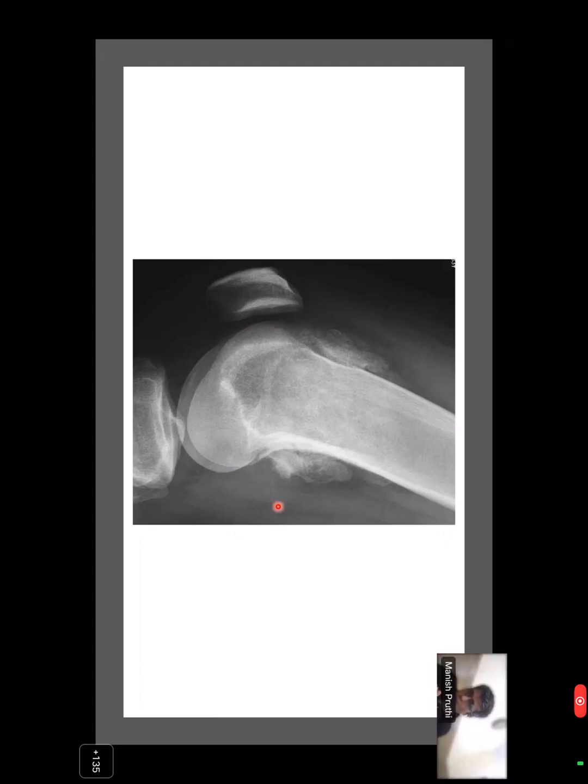And this is not a periosteal reaction, because periosteal reaction is periosteal new bone deposition. This is a dense bone which is surrounding. There is a mineralized mass. Sometimes you see a densely mineralized soft tissue component of a malignant bone tumor. But this looks like the lesion rather than a periosteal reaction, because you can see that the periosteum is not lifting here. Okay, sir.